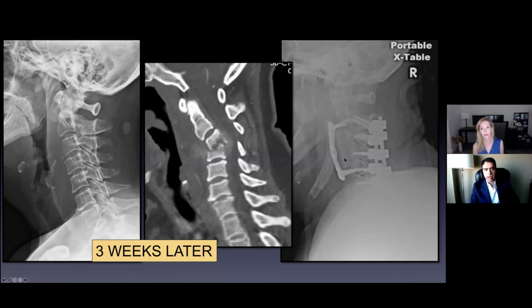Titanium is a little bit of a better choice. Now, again, I'm not going to say it's wrong. It's not wrong, but it's not the best option. Probably the best option would have been titanium, or you could even use iliac crest, which I would not use on this patient. That would be very difficult to get. But titanium is a much better choice.